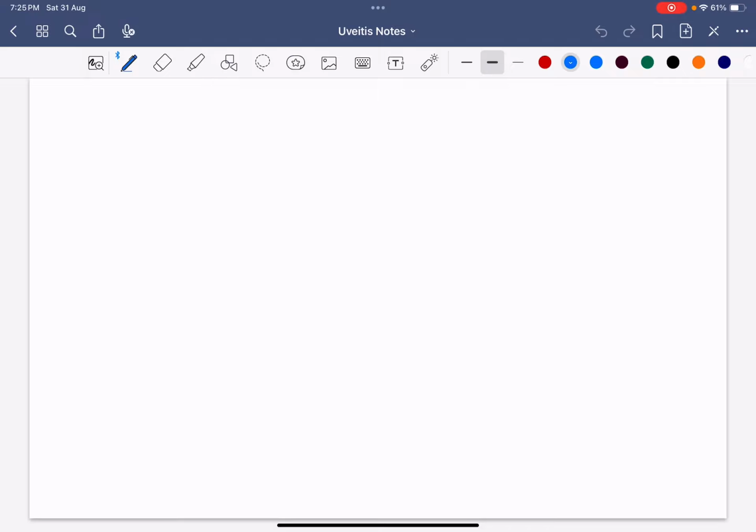So what you have to remember is how we do a LASIK. So this is my cornea. With the help of a blade, I make a flap. Let's say this is my cornea, so I make a flap of 110 micrometer. That is how the flap is raised.